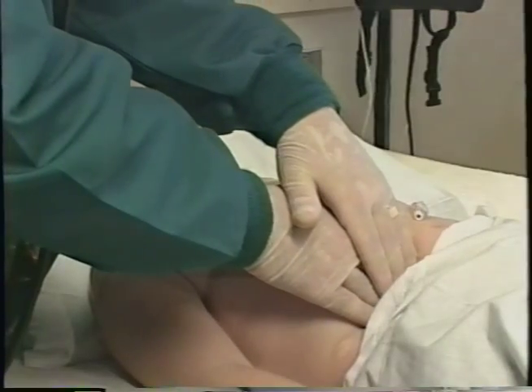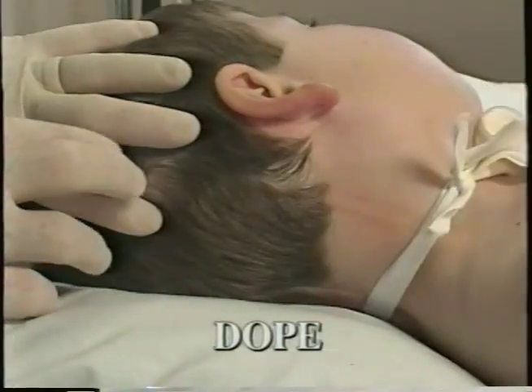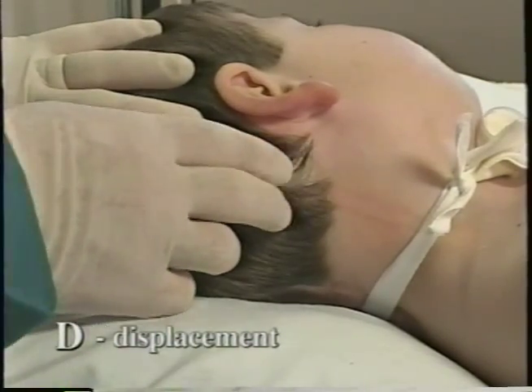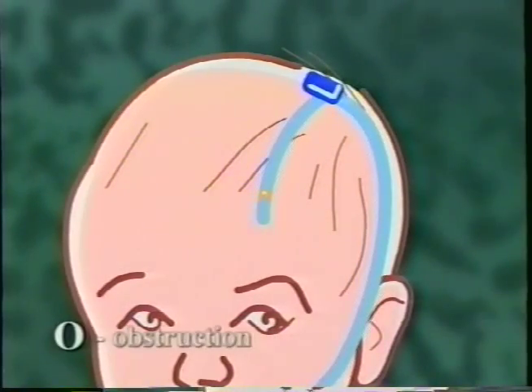Once again, a modified DOPE mnemonic may help localize the problem. D is for displacement. Is the CSF shunt displaced? O is for obstruction. Obstruction is the most common cause of CSF shunt failure and emergencies. Is the shunt obstructed? Blood clots or protein precipitates may block the catheter.